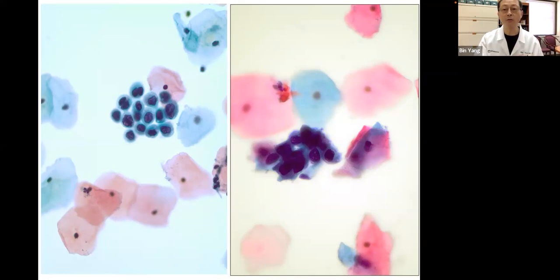They have nuclear overlapping like this, okay? But they're different from endometrial cells. I will show you. Those are much more 3D and you hardly see any space between. Like here, you've got holes in between. Usually those are relatively round and much thicker, 3D.